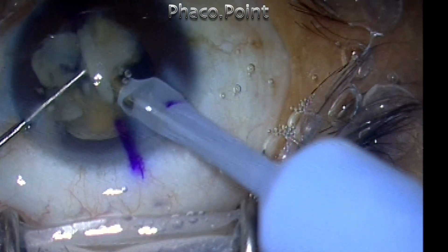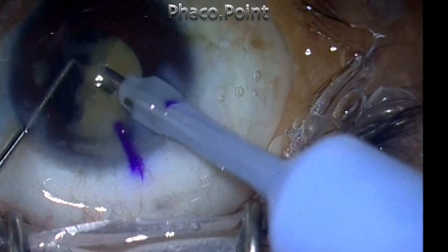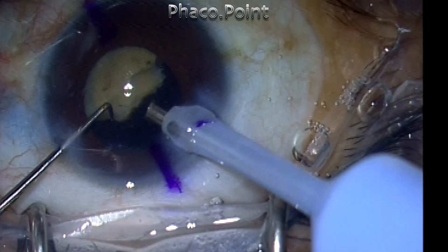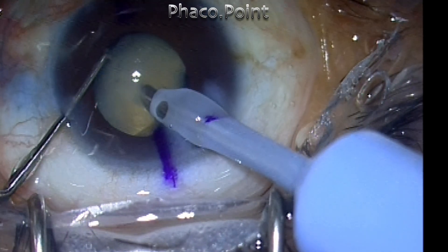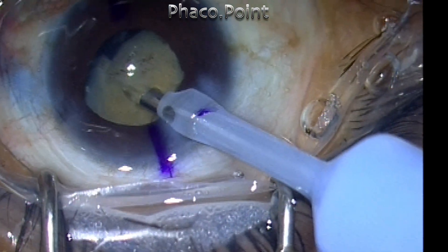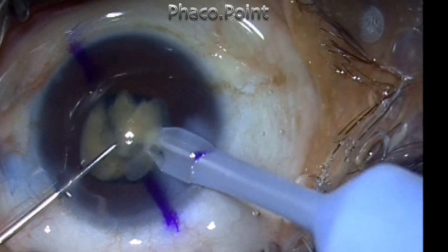Although this technique may look like it is a cross between a horizontal and a direct chop, or a peripheral and a central chop, this is the best way to do it — maybe you get the best of both worlds. The reason why you need to start the chop close to the periphery after getting a good hold is because the lens is a spindle-shaped structure, which is thickest in the center and becomes thinner towards the periphery. Once you start the chop near the periphery, it is easier to initiate the crack, and once started, it is easy to propagate it to the center using mechanical forces.